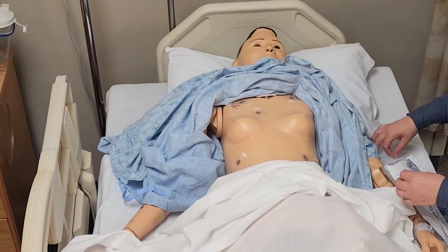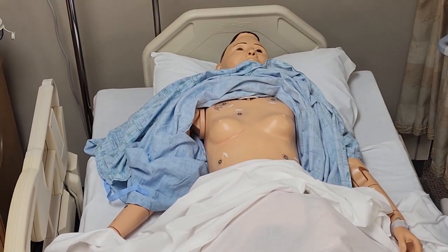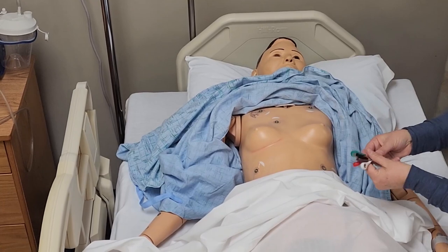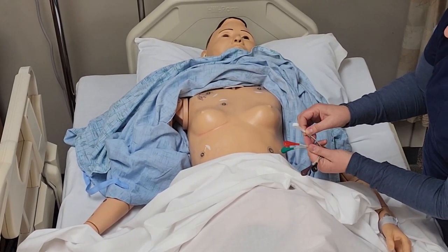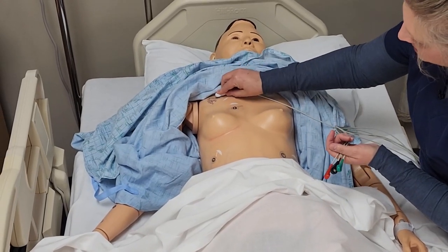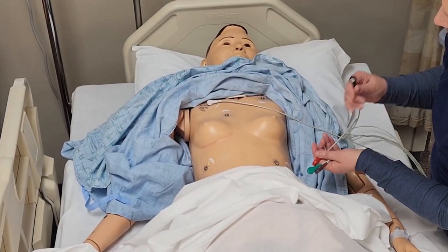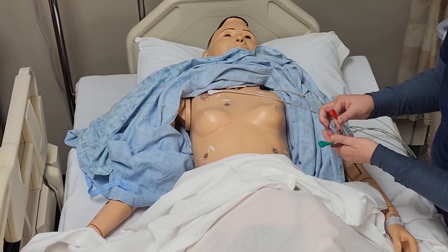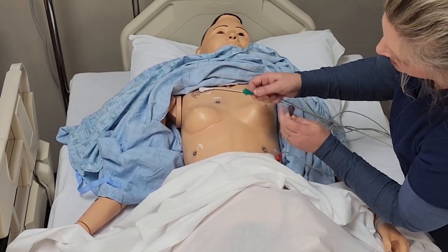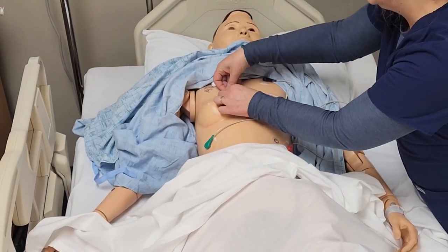Now that I have them placed, I'm going to go ahead and attach my wires. Your wires are color coded, and it tells you right on them if it's right arm or left arm. We have the white that's going to go on the right side, and then we have the black that's going to go on the left side. Then we have the left lower, and then we have the right lower, which is the green.